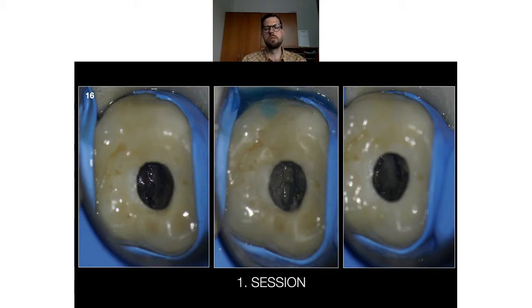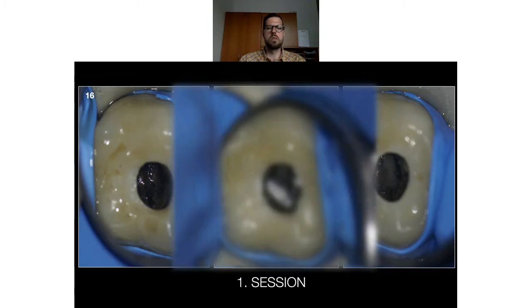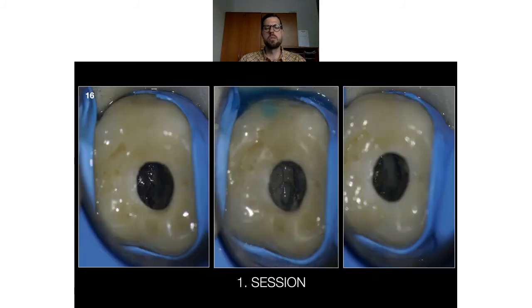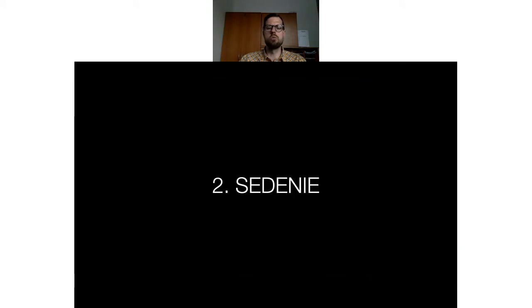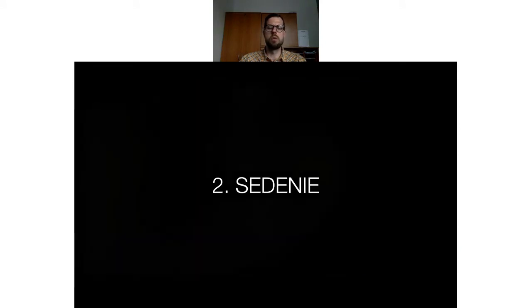And on this first session, we are cleaning all the pulp chamber, and we are dressing the tooth with calcium hydroxide, and we close the tooth.